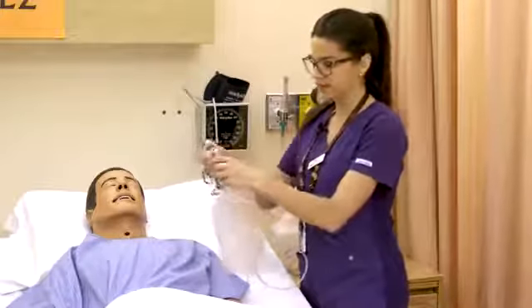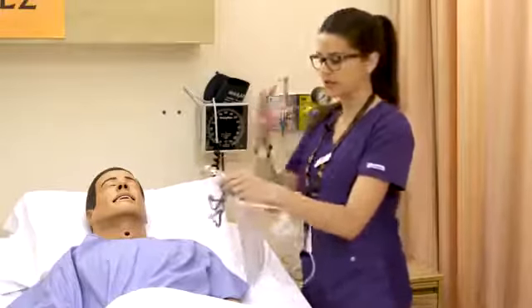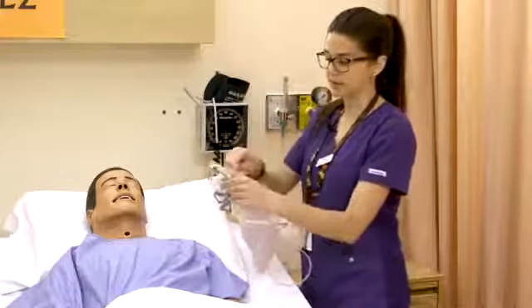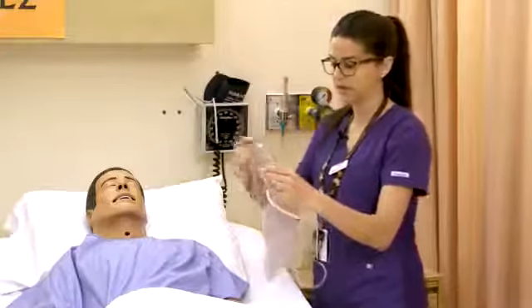And there are no valves, you'll notice, on these side ports, so they can also exhale some air out or inhale some air from room air, because these are open holes that they are pulling a little bit of room air through potentially as well when they're breathing.